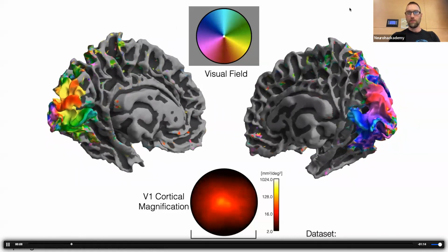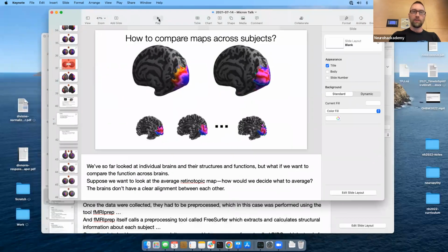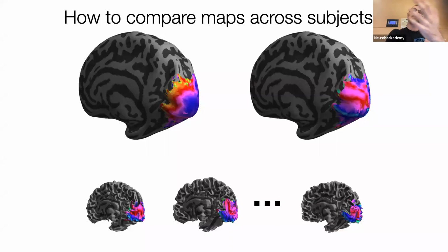But real quick before I jump into actually showing you some code or looking at directories, first of all, ignore the slide for the moment. People use FreeSurfer for all kinds of reasons, not just cortical surface comparison. For one thing, FreeSurfer will automatically segment your data into gray and white matter, and that's hugely valuable. I've never had to manually segment a brain, thank goodness, because FreeSurfer's always been around for as long as I've been around. But my advisors had to go in and manually click every voxel that was white matter and manually click every voxel that was gray matter. That was months of work by itself. FreeSurfer does that automatically nowadays.